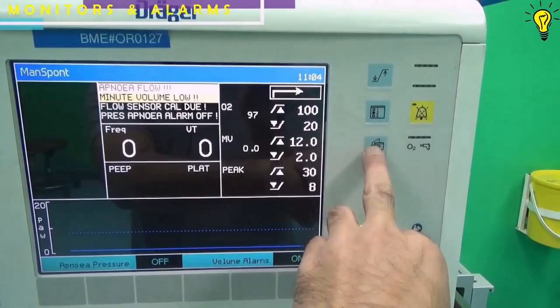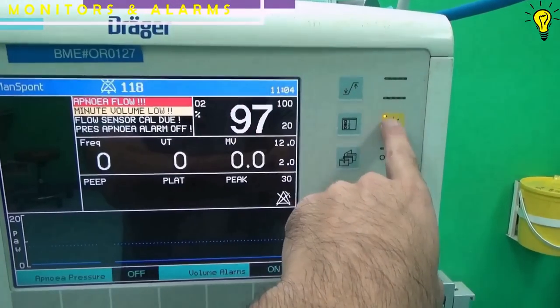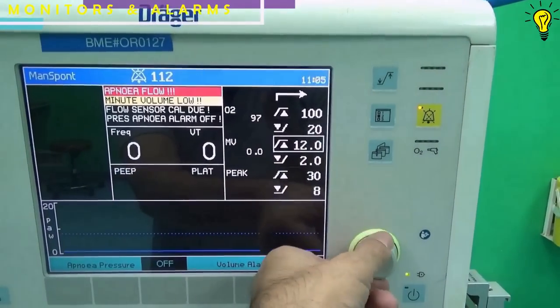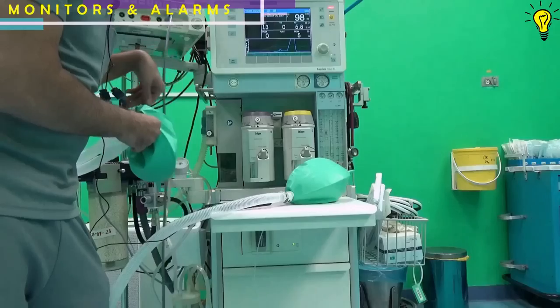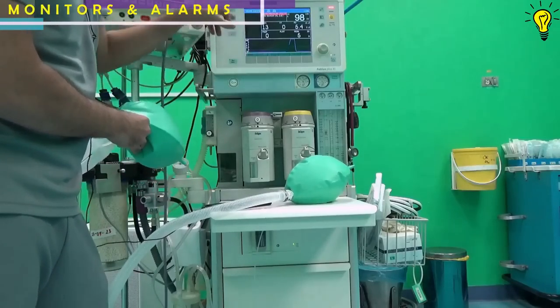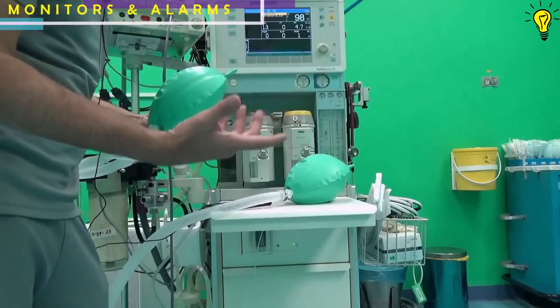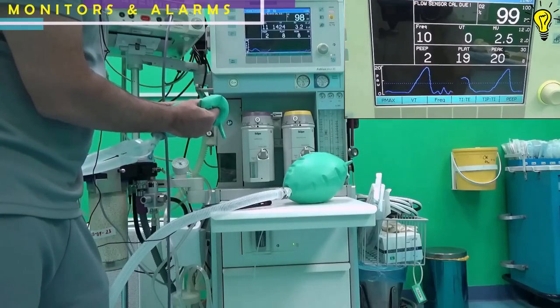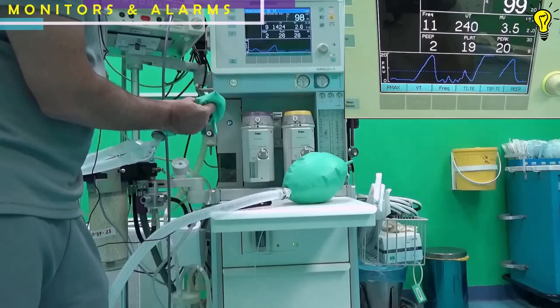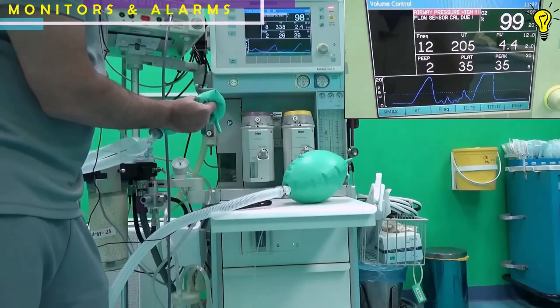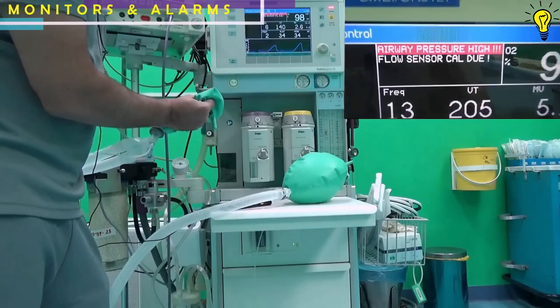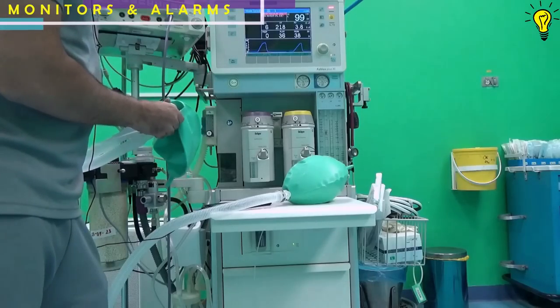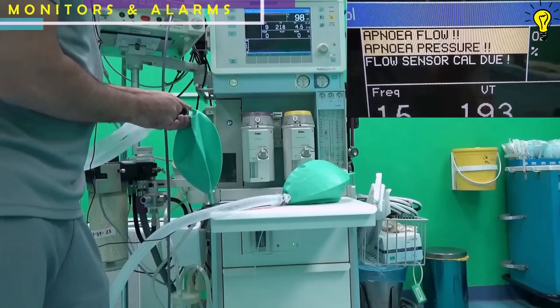Next step: check the monitors — the Capnograph, ECG, and vital signs monitoring system — and set the alarm limits for various parameters like pressure and minute volume. Attempt to create high and low pressures during automatic ventilation to check if the alarms are working fine. Gently squeeze the test lung to artificially create high pressures; the alarm should ring and the monitor should read high airway pressures. To detect the low threshold of pressure alarms, detach the test lung and the machine should read it as apnea pressure.